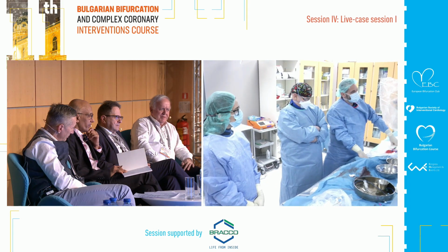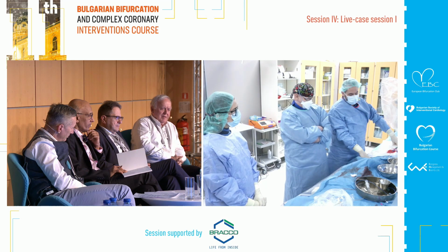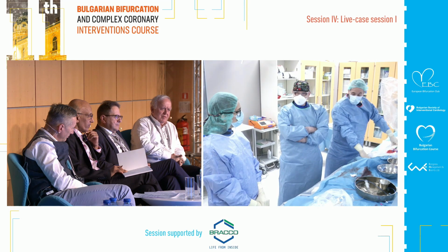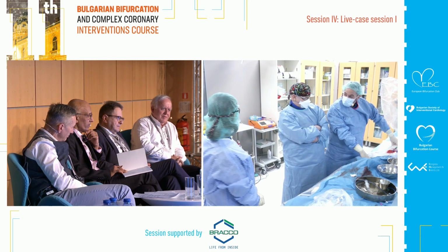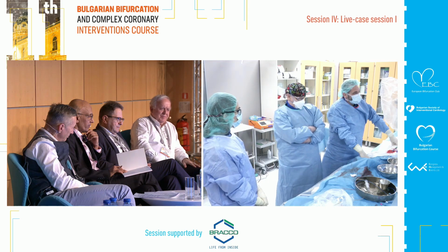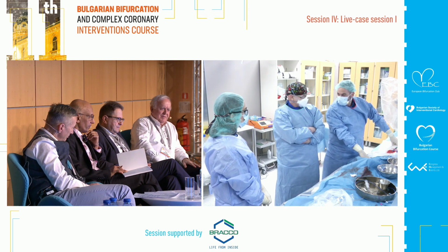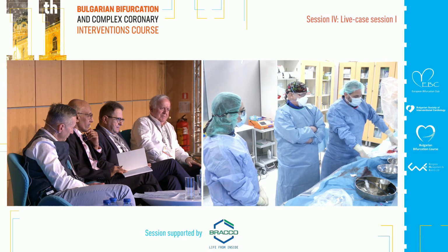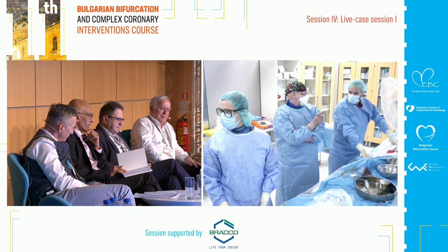I have some concern about pre-dilating or not, because the plaque is very soft, so maybe we don't necessarily need to pre-dilate. What about you? I will go for direct stenting. Yeah, that will help us to keep the stent in place.